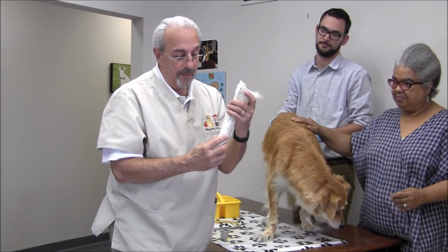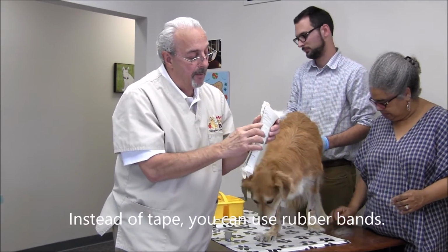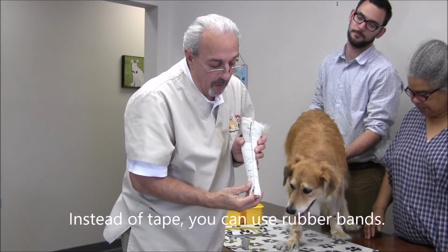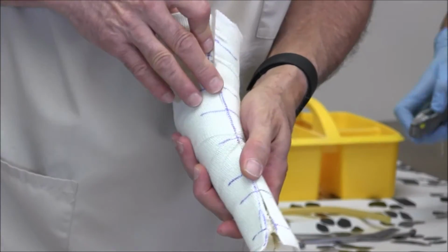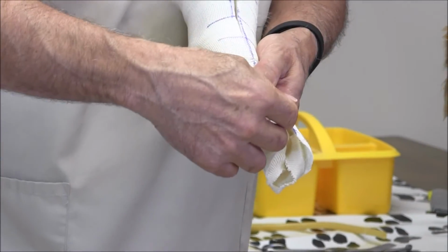Okay. Now once we got the cast off, what we're going to do is close it up, and then we're going to tape up by matching up our marks so they're in good alignment. We don't want it where it's out of alignment. We'll match up our cross hatches, and then we'll put tape right around there.